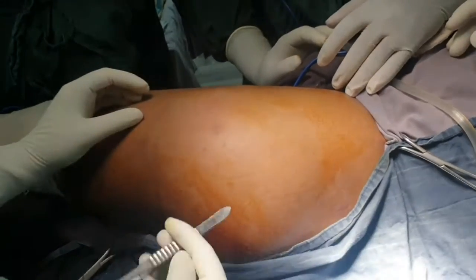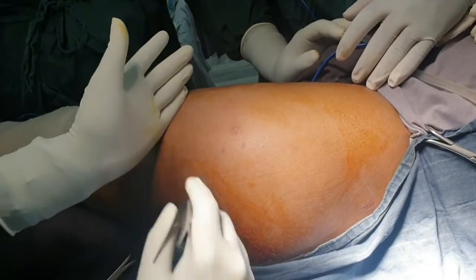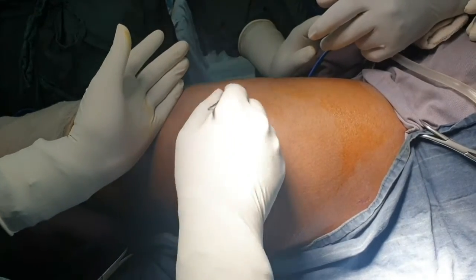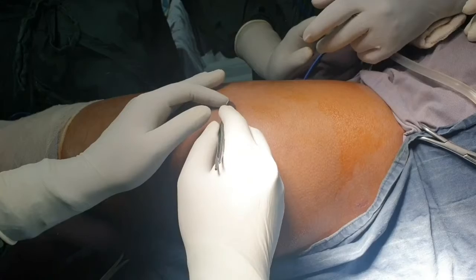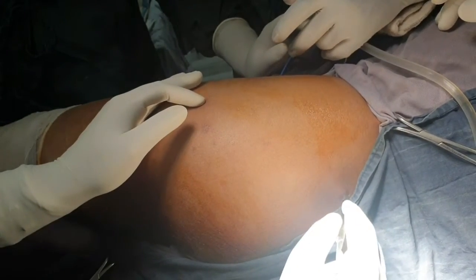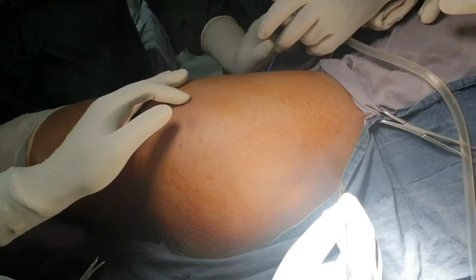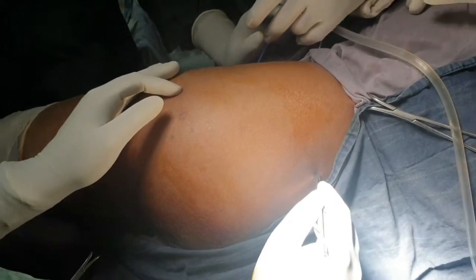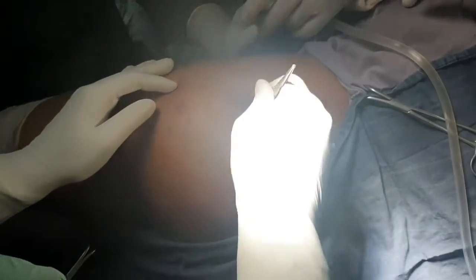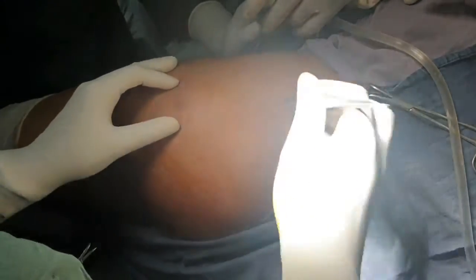The usual incision should be from the mid thigh directed towards the greater trochanter, followed by a curved incision directed posteriorly up to the posterior superior iliac spine. The standard approach is a little bit distal and inferior to the initial point of incision.